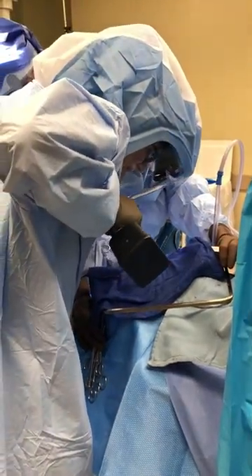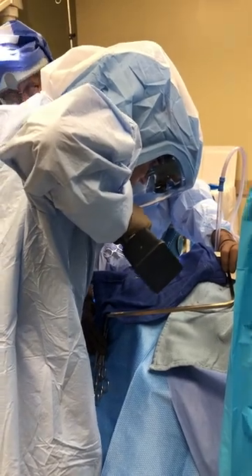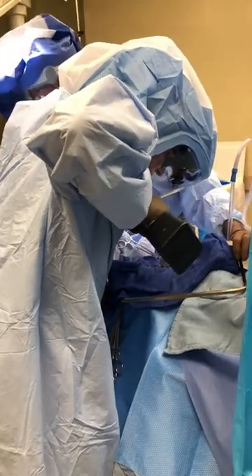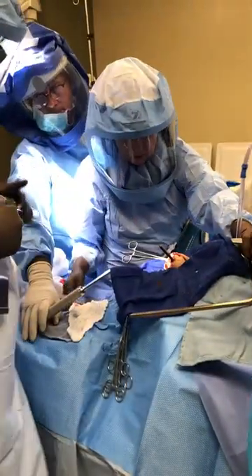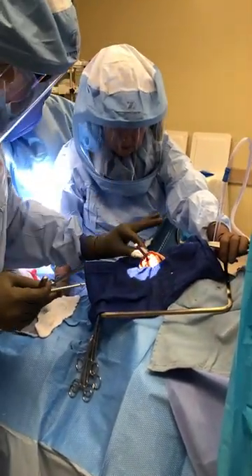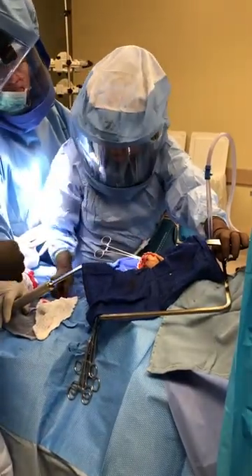It's approximately equal anterior-to-posterior here because he does not have a cam deformity. So I'll cut it all the way off now. Once you put this post in and make the big drill hole, you've bought your position. You don't have to really do any checking at this point anymore.